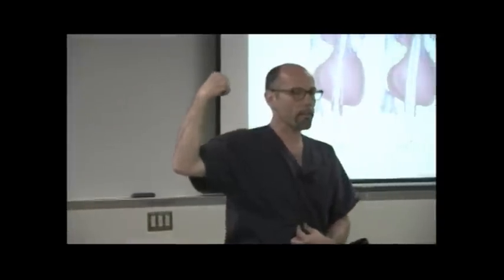But there are centers that keep these in patients for months. They actually put them in what's called retrograde. So they put them in through a sternotomy incision into the aorta upside down so the patient can be up walking around with their balloon pump in. Okay? I'm not going to get into all the wheres and whys and hows of what they are doing this for. It has a lot to do with insurance reimbursement.